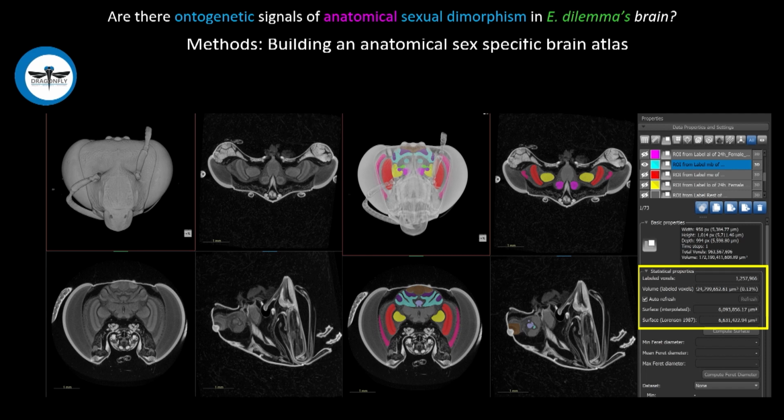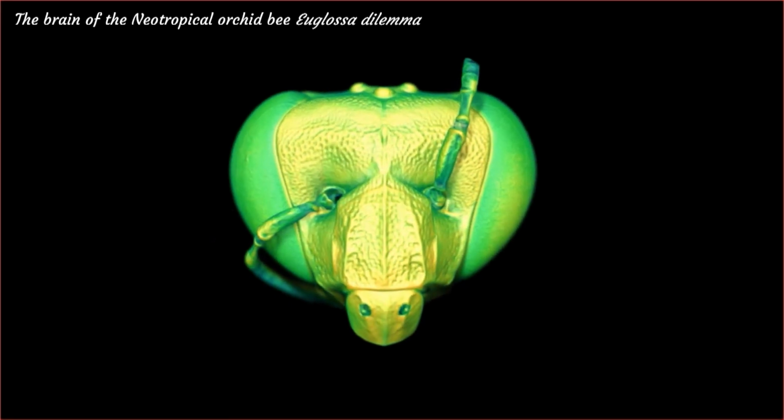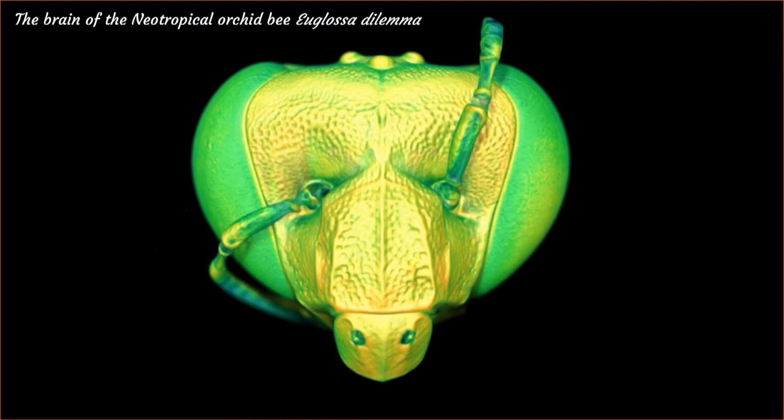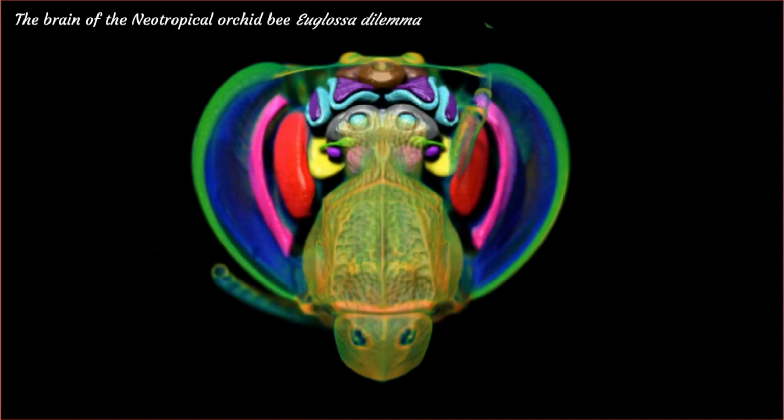And I had mentioned the voxel size. Even though the bee brain is much smaller than the mouse lung, it ends up that the matrix dimensions in the bee brain are about 2.5 to 3 times the matrix dimensions in the mouse lung. This has a big consequence for deep learning, which I think you can imagine. But before I get to some of the results and talk about that, this is a really nice movie that Denise made for the bee head and looking at the structures inside.